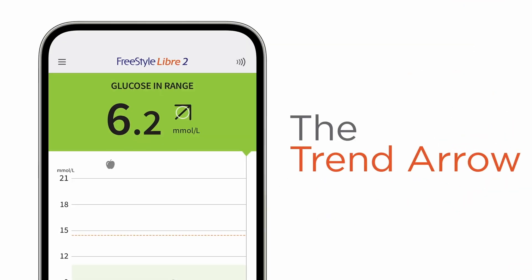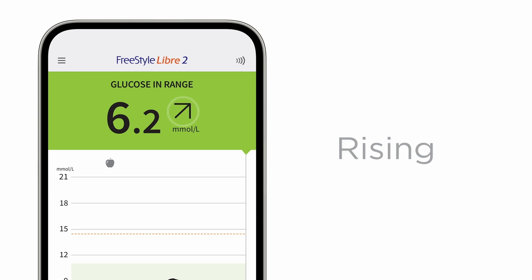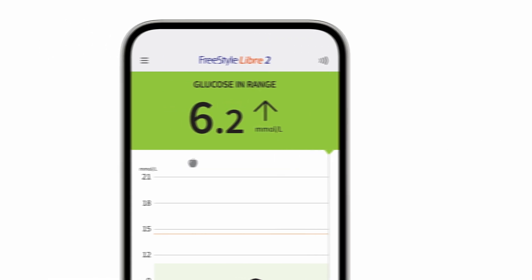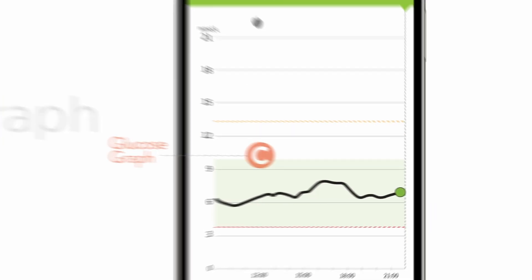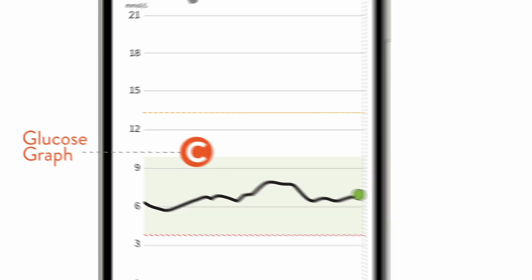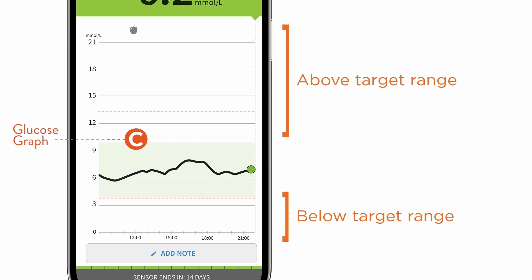Your trend arrow shows you what direction your glucose levels are heading in — changing slowly, rising, falling, falling quickly, and rising quickly — allowing you to act instead of react. Eight hours later, you'll see your first complete glucose graph. It plots your readings and shows you the last eight hours of readings, and also tells you how much time you are in or out of your target range. It helps you understand where your glucose levels have been.